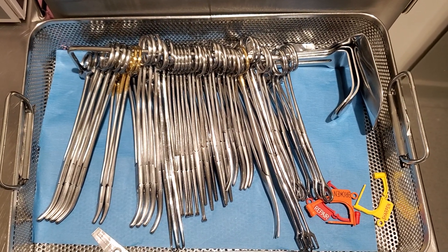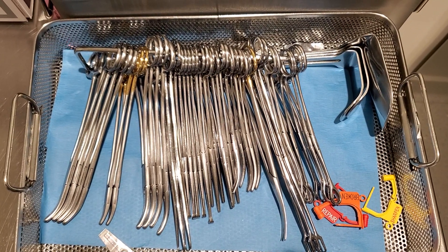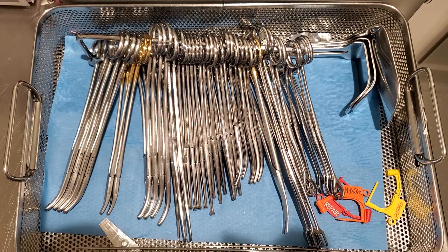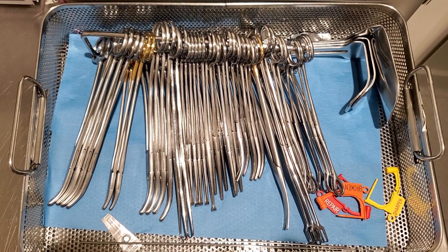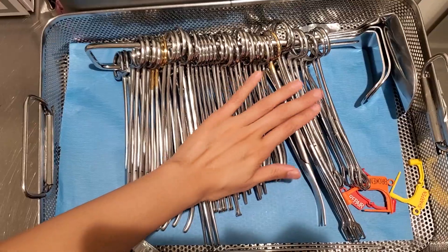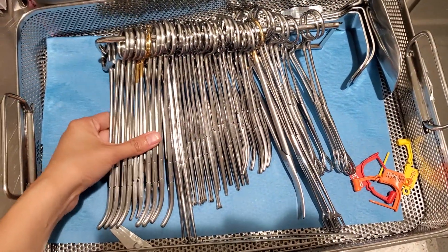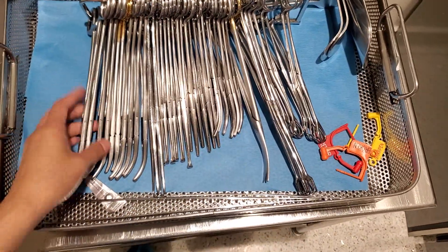Hey guys, today's video we're gonna go over a hysterectomy tray. It's very small and it kind of varies in other facilities because at my other facility we have more instruments in this. So let's just go over it really quickly. I don't want to take it off the stringer because I have to send this back to central sterile — they're just gonna go straight in the autoclave because I didn't get to use it.